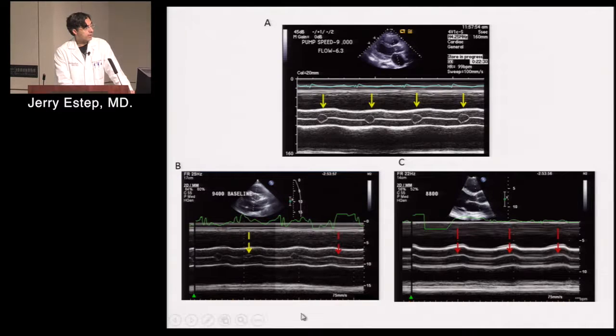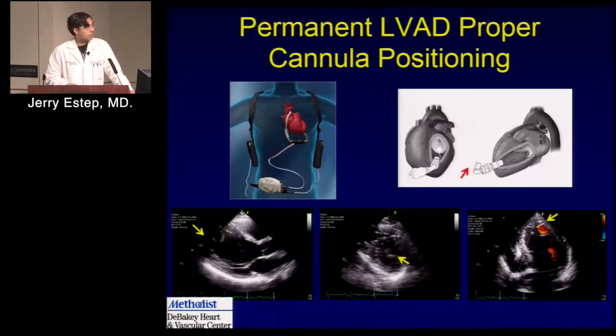If you have a pulse, you have a pulse pressure, and the cuff can be used to understand blood pressure. If you have no pulse, as exemplified by here, or very partial pulse, then we're really relying on Doppler to understand that the opening pressure in someone without a pulse is the systolic, but it's so close to the mean, because the systolic and diastolic are so close together, we call it the mean. So that's an important takeaway.